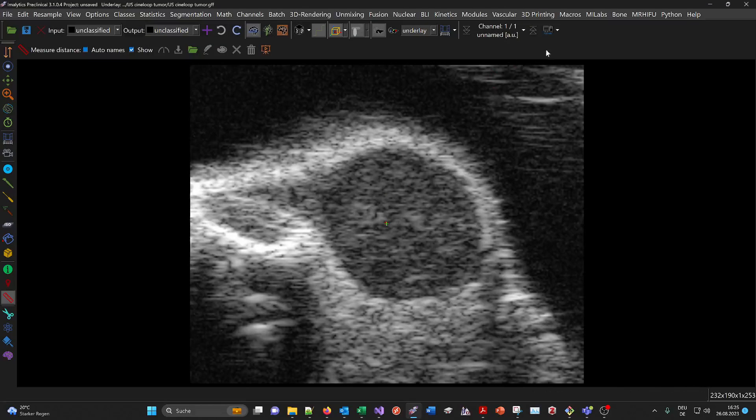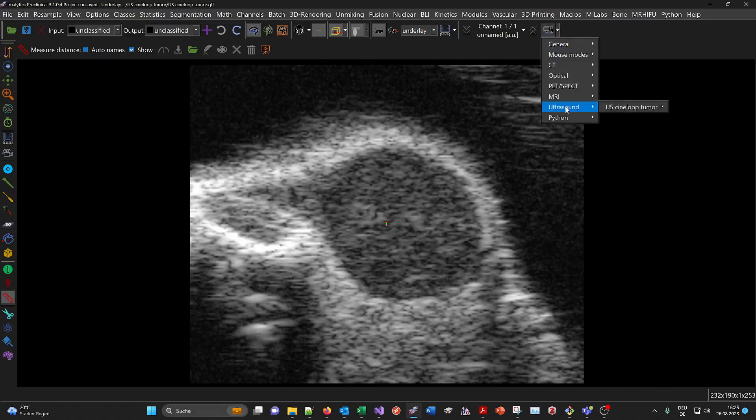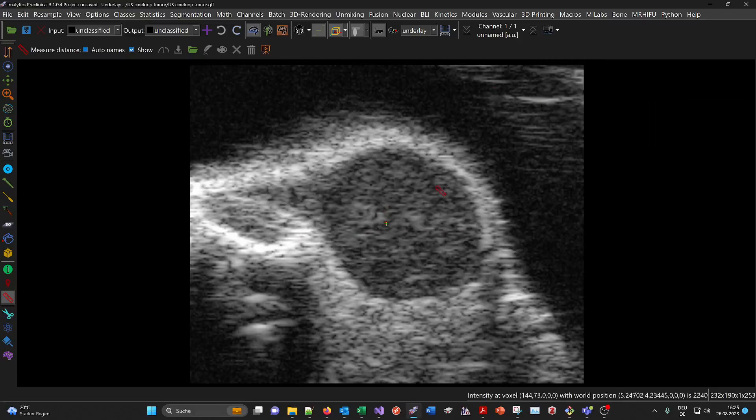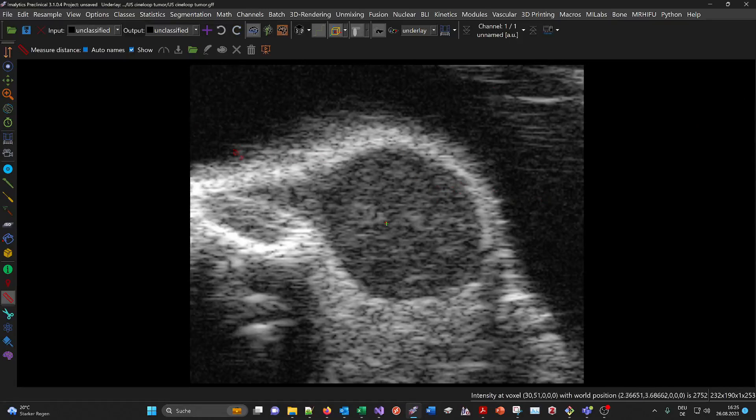You can load this dataset from the tutorial button under the ultrasound submenu, and then ultrasound cine-loop tumor load example dataset. This is just a single slice over time.